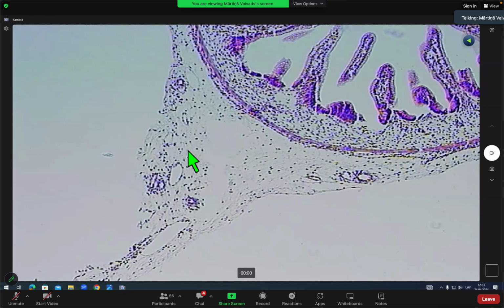So also a relatively simple slide. Here your histology knowledge will be quite helpful in understanding the structures. So, is this slide okay? Understandable? Yes, there's a question.